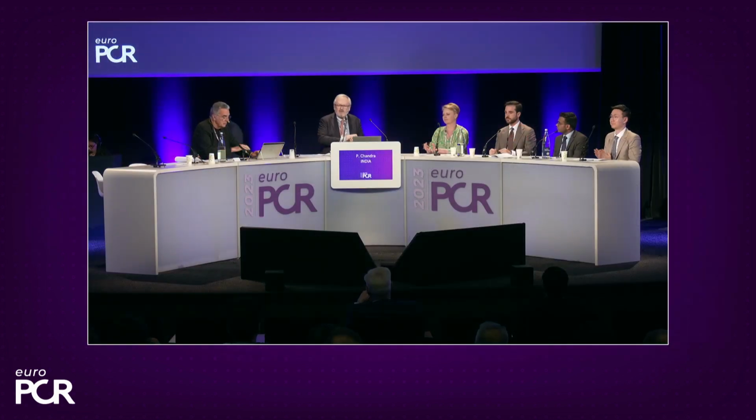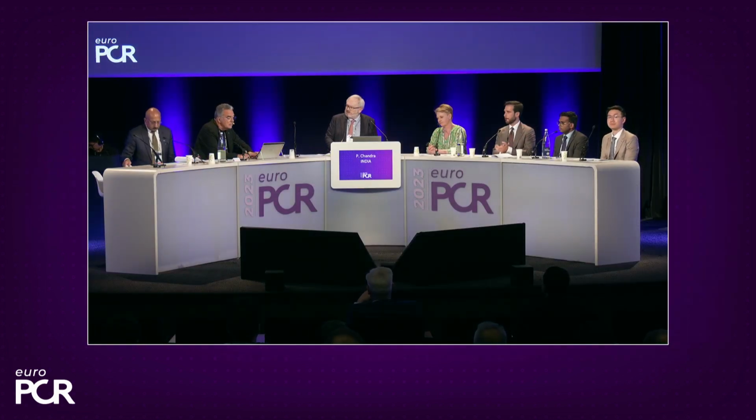Excellent, Praveen, excellent. So now we have seen enough slides, Jean. I think it's time to go to the lab and call Bruno. And Patrick, question? Two questions concerning the stent itself, the presentation of the stent. The first one is, after maximum expansion, what happened to the polymer and drug release?